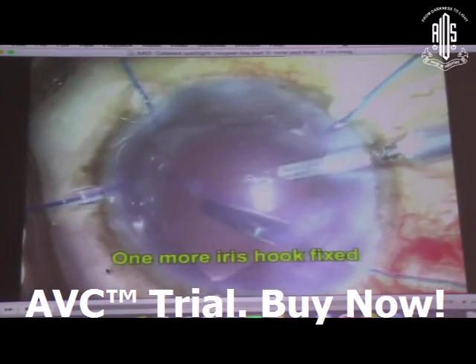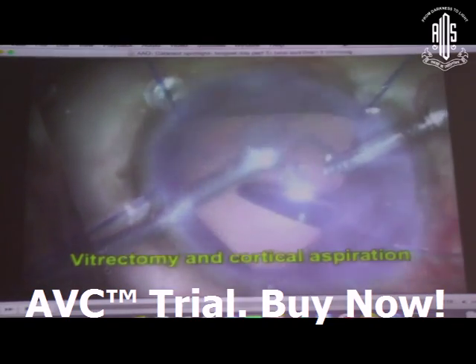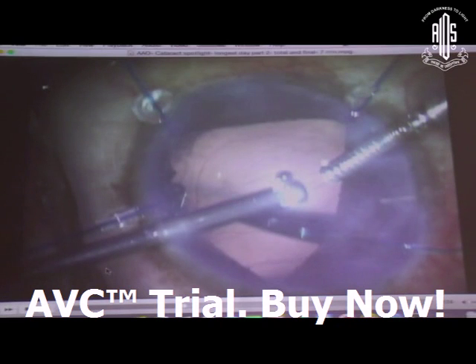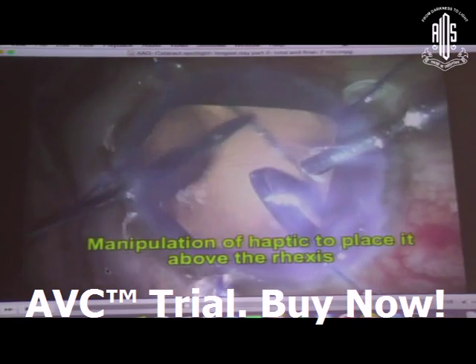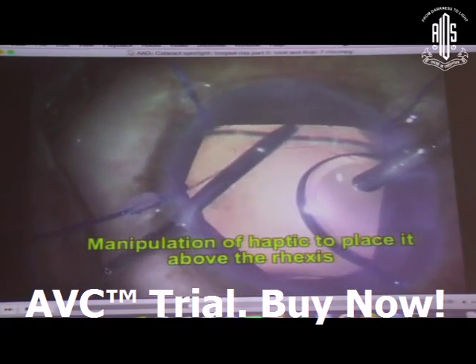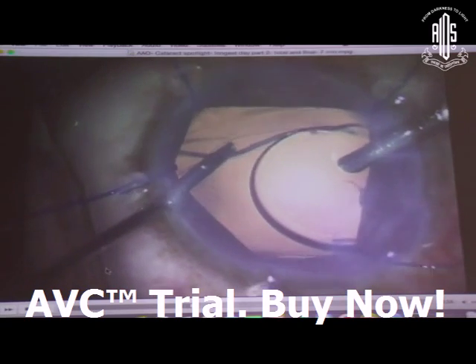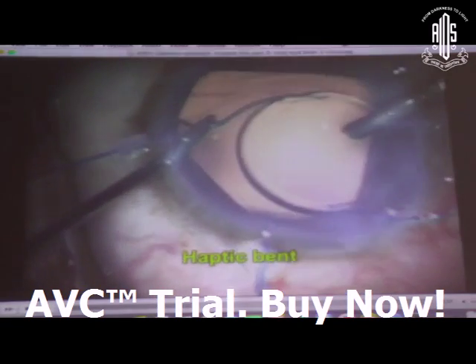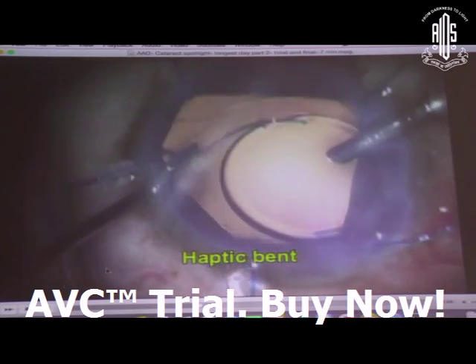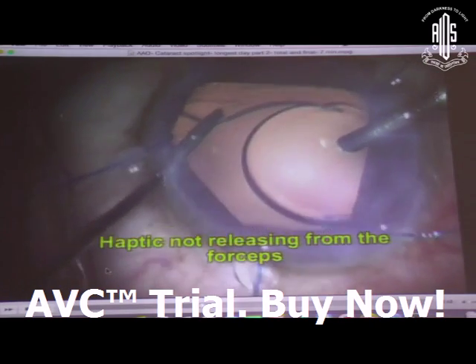Now the rest of the surgery I thought is going to be very easy. So what I'm going to do is I'm going to just take this IOL and I'll just implant it above the rhexis margin. So imagine I caught that IOL and I was just going to put it above the rhexis margin, and to my dismay the forceps got jammed. So you can see how I was going from one end of the frying pan to the fire. At this stage nothing else to do but start praying, because that forceps is totally jammed.